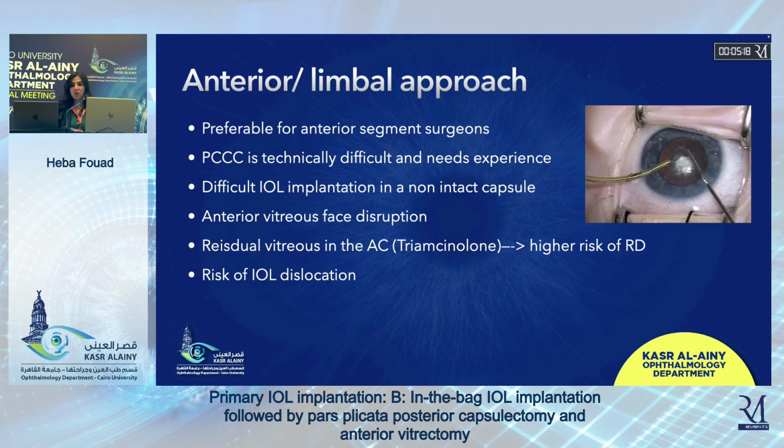The anterior approach, like my dear colleague Hels mentioned, is preferred by the anterior segment surgeons. However, it has a lot of disadvantages, such as the difficulty and the experience needed for the posterior capsular rhexis, difficult IOL implantation in a non-intact capsule bag, anterior vitreous face disruption, and the residual vitreous in the anterior chamber.